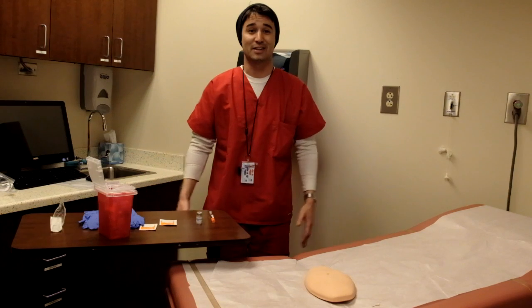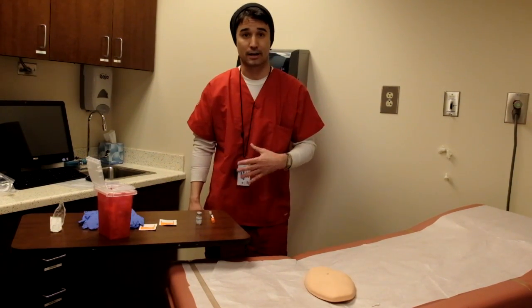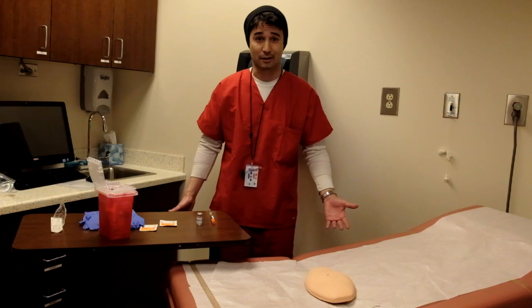Hi, my name is Justin Day and I'll be demonstrating how to withdraw medication from a vial and how to administer a sub-Q injection as well. So let's go ahead and begin.